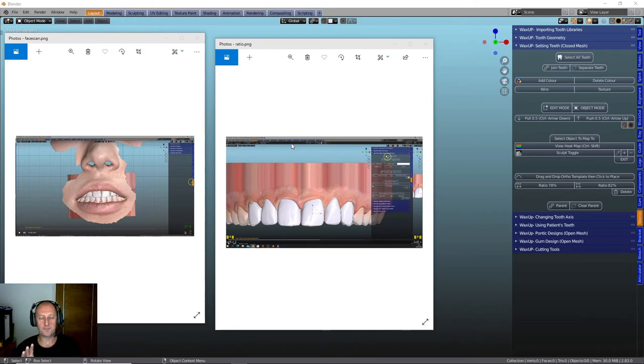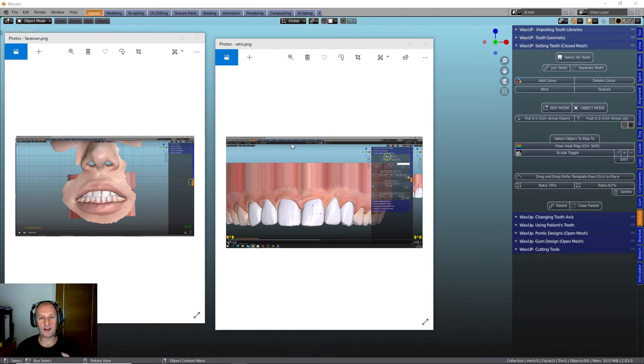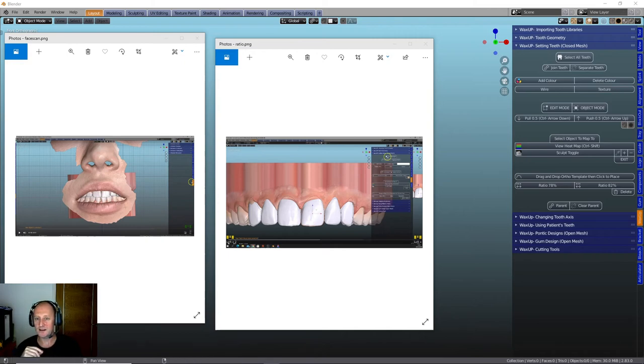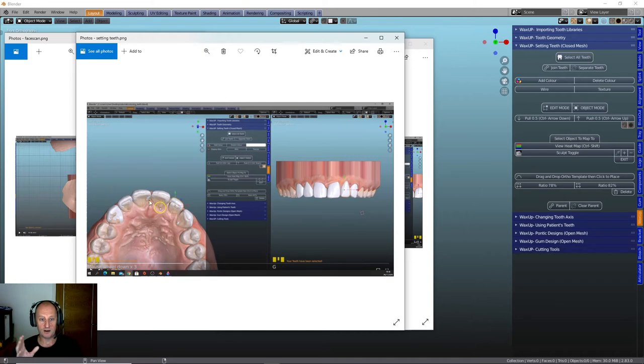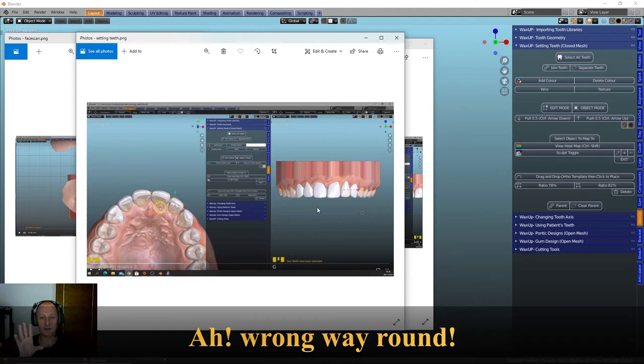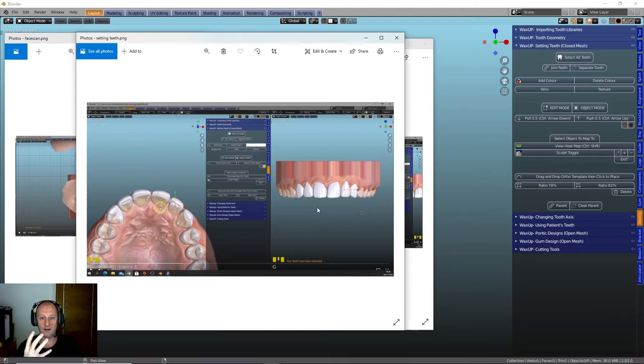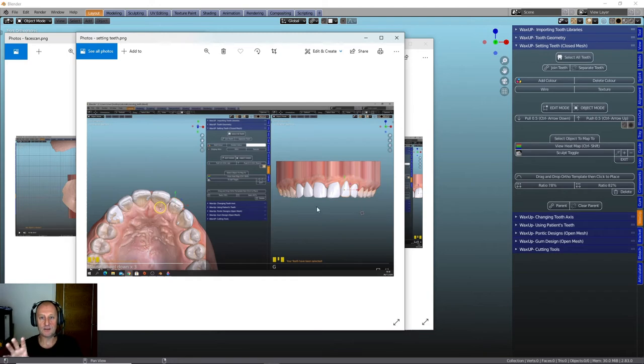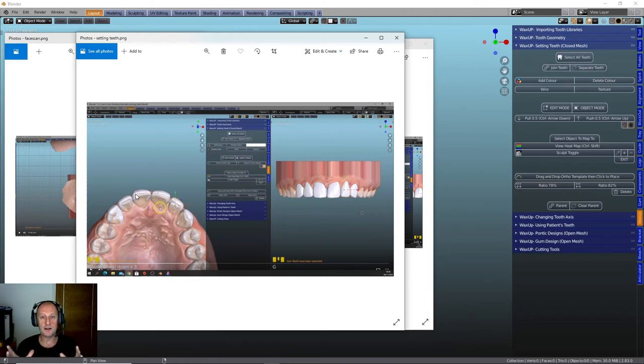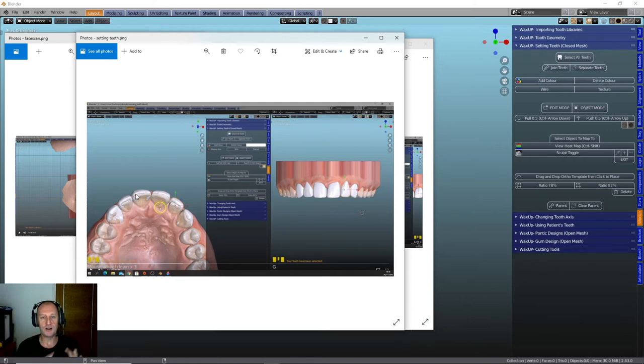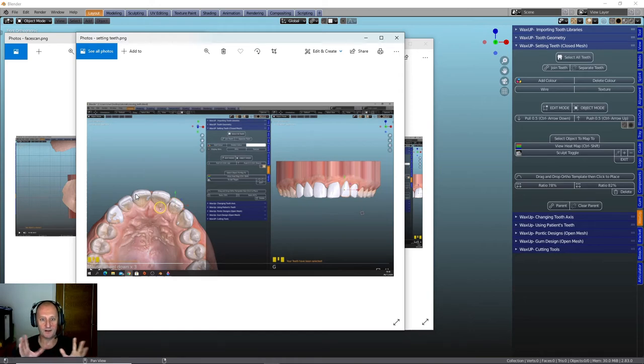Now, moving the teeth, one of the great things about Blender, because it's not necessarily written for dental work, we can use those features of movie makers and all the other bits and pieces to help us. So one of the things I do quite like is this feature here where we can split the screen open and we can have two views. And what the guys have suggested is that you have one view on the left there that you can see from the occlusal surface and on the right you have it from the front, the view from the front. So when you move the teeth on the left-hand side, they obviously move on the right as well. So you can then get an idea without having to keep moving the model, you can get two views. Now, theoretically, you could open up another window depending on how many screens or how big your screen is. You can have numerous windows open with the model in different positions so when you move it on one, you get the visual effect on all of them. So that's probably one of the nicest features I've found working through this module and the most useful as well.